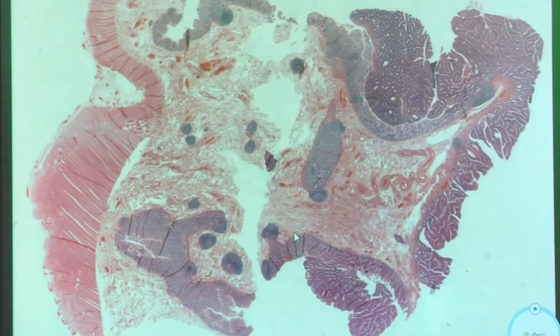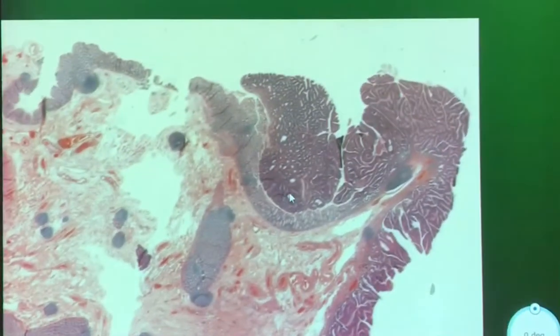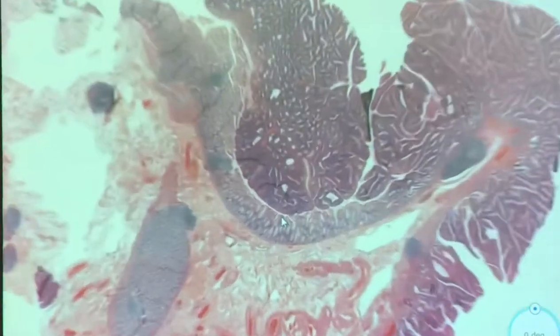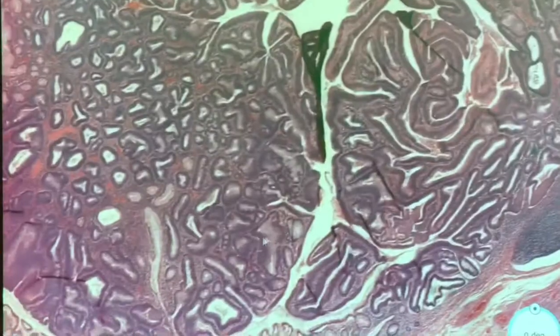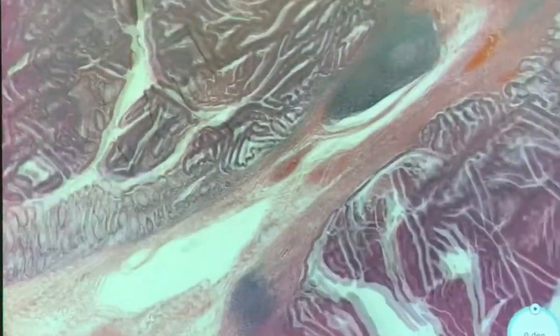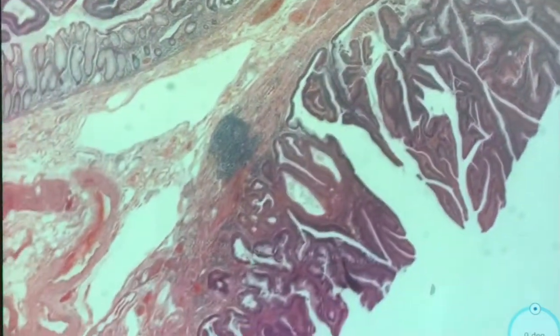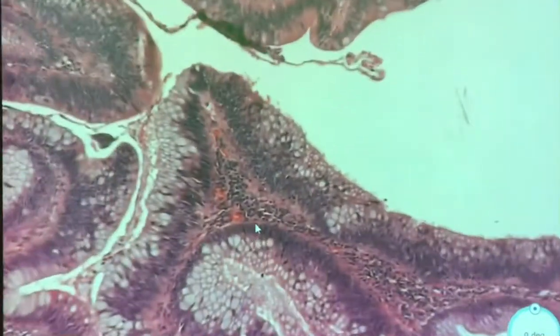This is case 7. Ooh, mushrooms. Well, it's a pretty big biopsy. I know, isn't it nice? Probably because they did a resection on this. Yeah, okay. Well, this is where the fun part is. So let's take a look. It's not really invasive. That's good. Yep, that's a good start. I like that. We're always happy for a patient when we get to say not invasive.